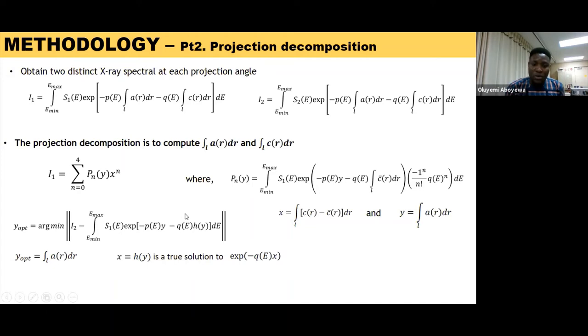We know all of this already. We solved for this from the polynomial. We know this because there is a physics equation that already described that from the Klein-Nishina Compton equation. We can calculate this. We know this from the polynomial solution. And then you can optimize Y by putting in a Y value that minimizes this whole expression, that returns the minimum value for this expression.